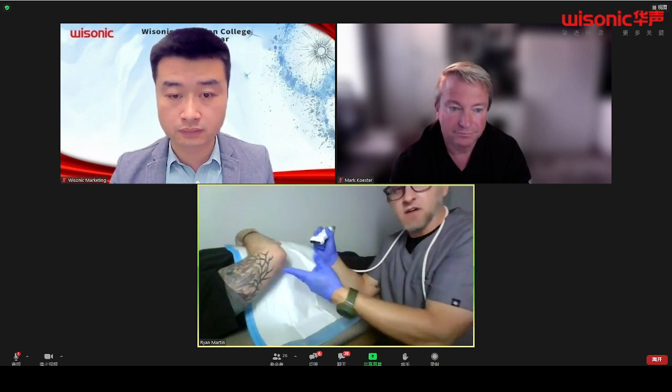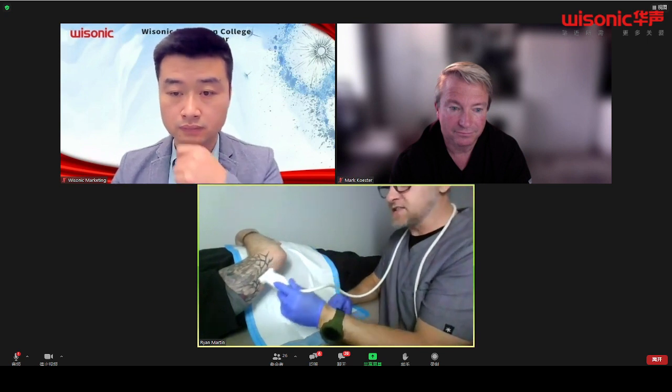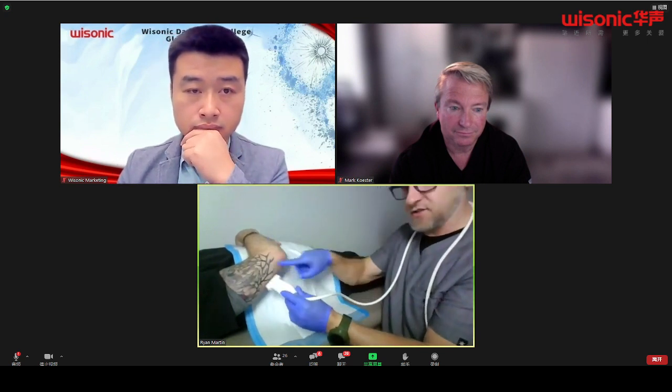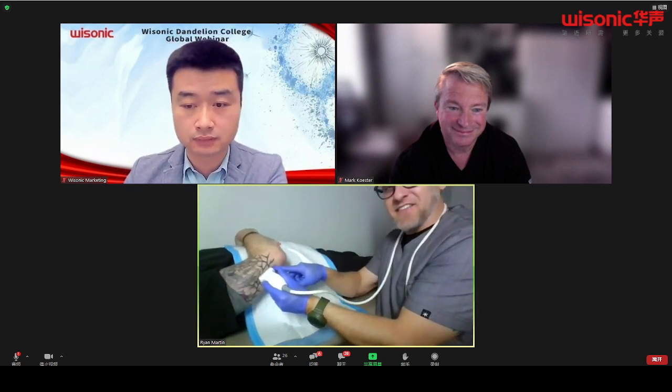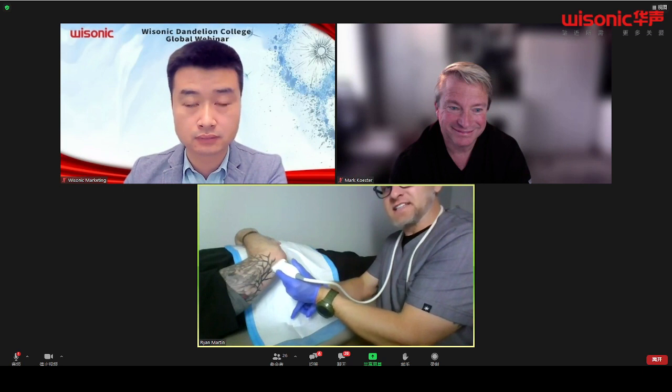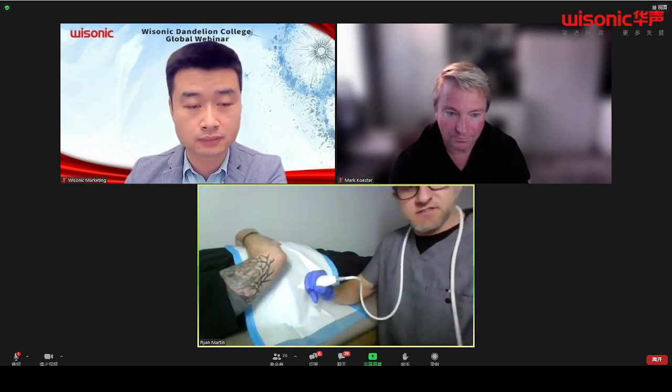But while I'm here, I can easily look at the tricep. So right here, that's the long axis. So there's the humeral shaft, radius, humerus. I do know my anatomy. But right here, on that distal humerus, you're just going to follow that down until you see the olecranon, okay? So let me show you what that's going to look like on the screen.